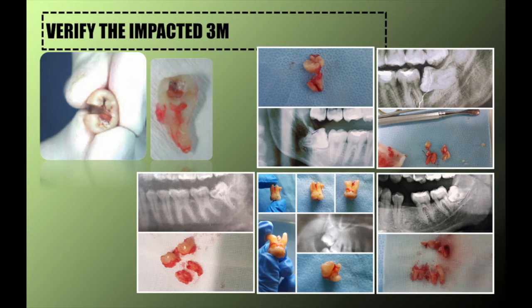is essential to ensure that you have not left any part of the impacted tooth behind. As a personal insight, in the unlikely event that a segment of a tooth fly out during retrieval or if it fell to the floor, inform the circulating to record that a part has fallen off. And, if possible, retrieve it for validation at a later time when it may be possible.